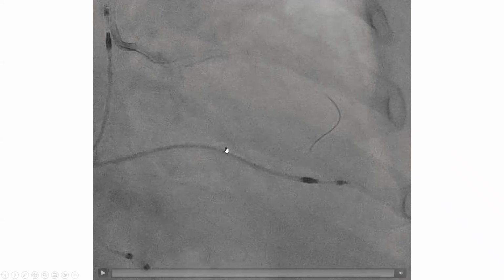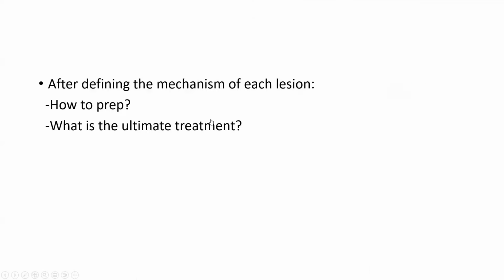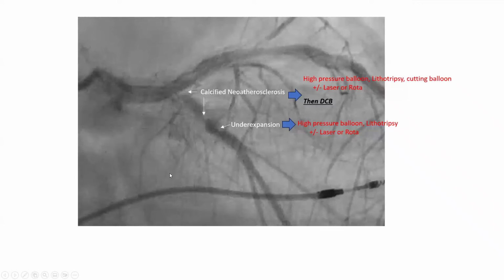And I want to indicate here one issue we can encounter. When you're crossing so many stent layers in the left main and into the circumflex, if after wiring you have difficulty advancing a balloon, including a 2 millimeter balloon, that usually means that your wire has gone beneath the stent struts somewhere, whether in that left main stent, which was placed relatively recently in 2024, or maybe behind the stent struts of that underexpanded stent also placed in 2024.